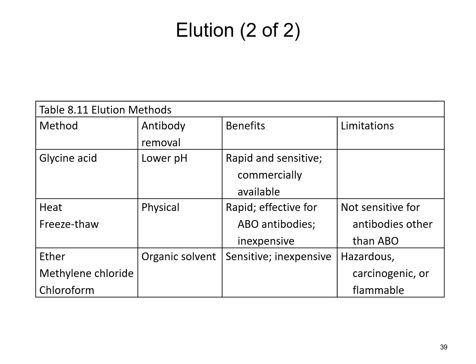So what we do is freeze those red cells for a little bit of time, 10 to 15 minutes, whatever we can do to get a rapid freeze. Then you'll run them under warm water to do a rapid thaw. When you do that, it ruptures those red cells and releases those blood type antibodies. And then we can do some testing to see if that is what's present.